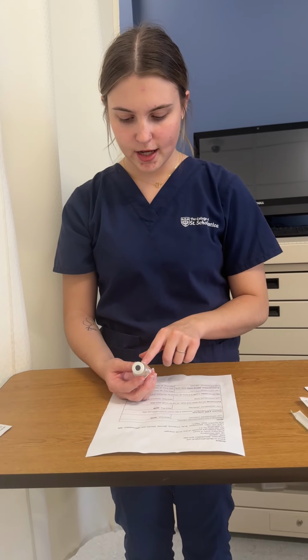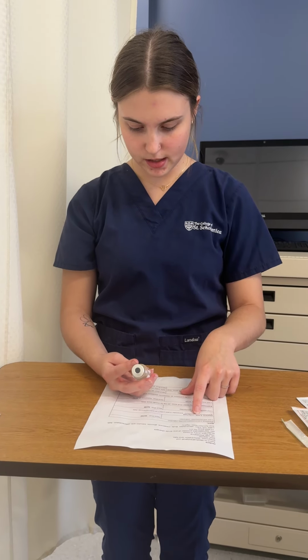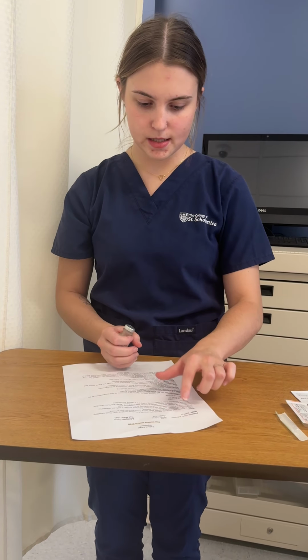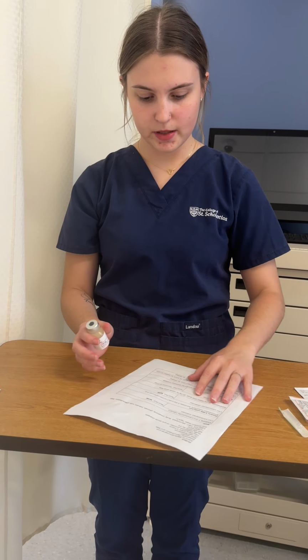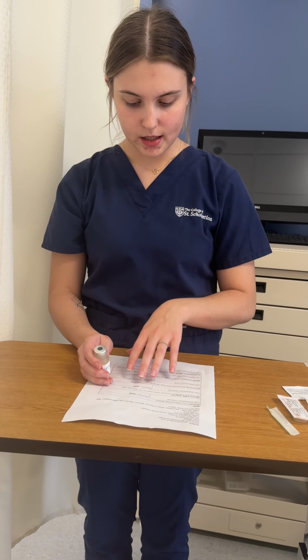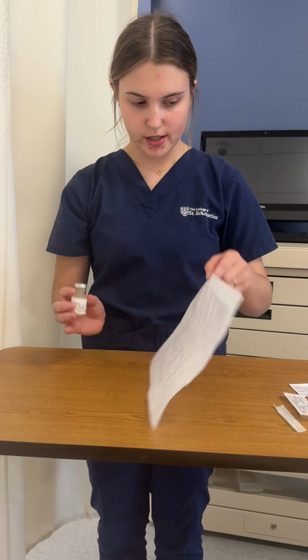So we have heparin. This is to prevent blood clots. We have 5,000 units per 1 milliliter. It is for Sam Johnson. This will be administered subcutaneously, and it is due now since it was last administered yesterday.